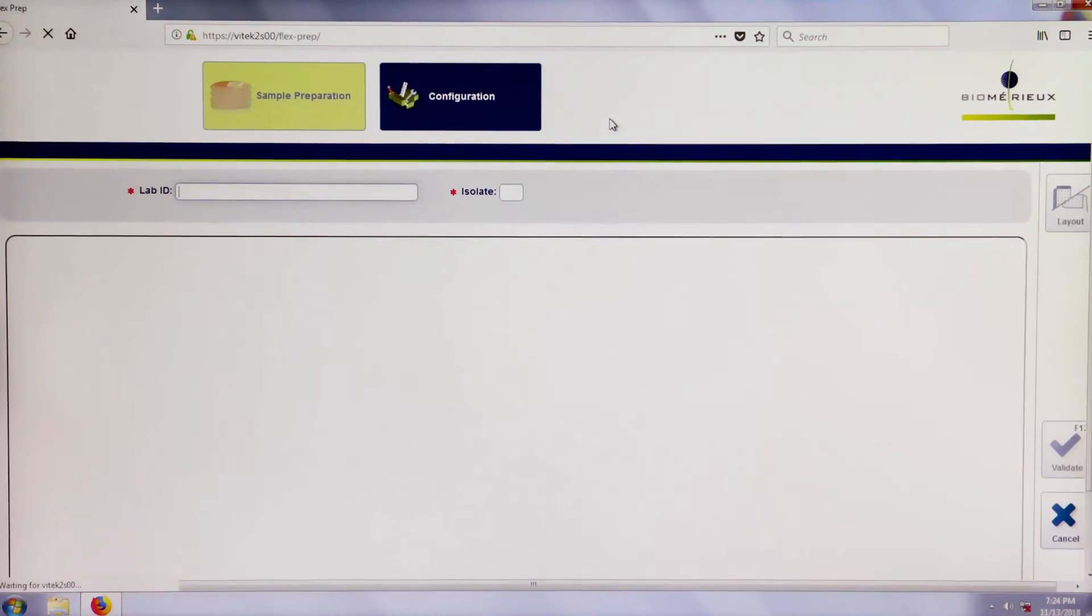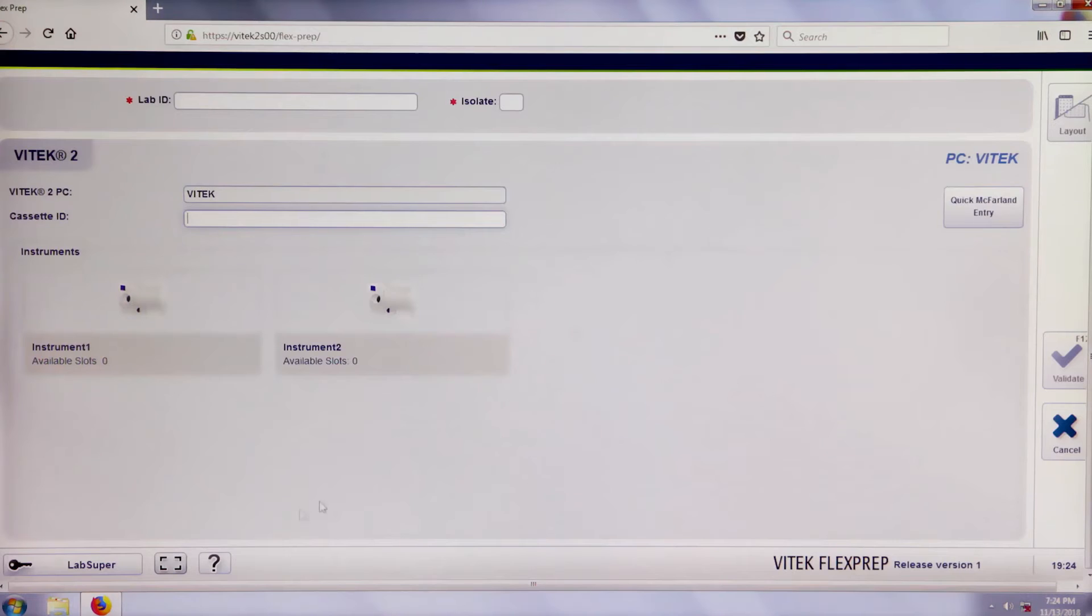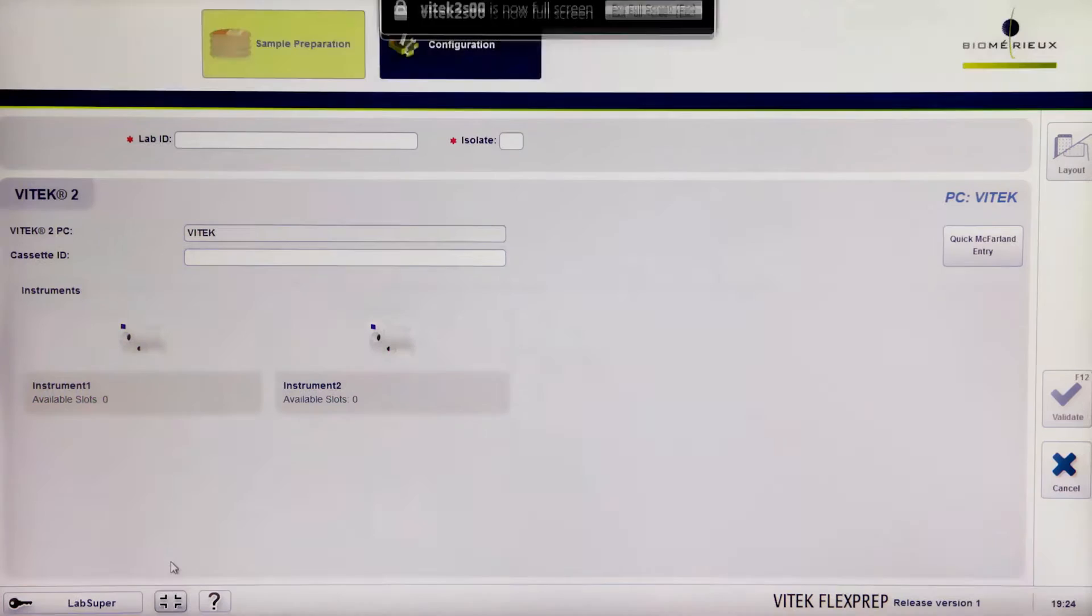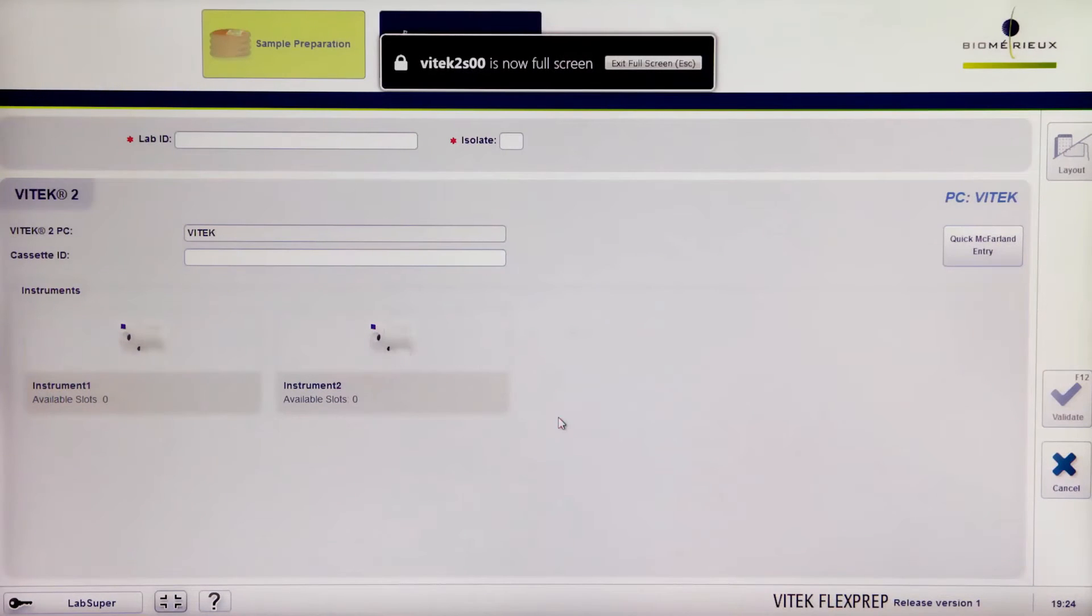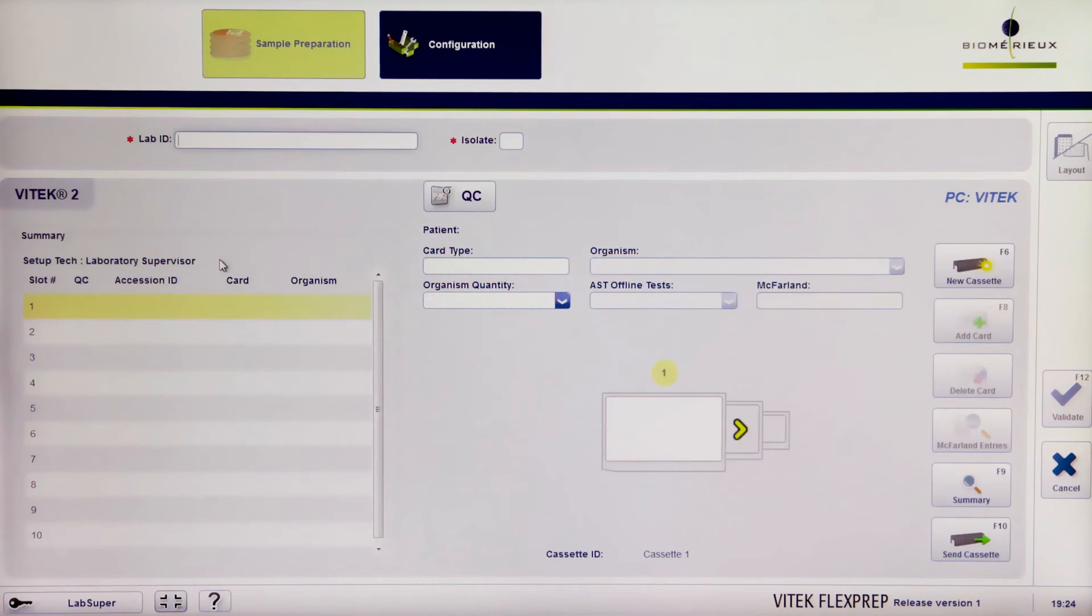By default, the sample preparation screen will display. Enter full-screen view. Enter a cassette ID and then press Enter. This will pull up the cassette definition screen.